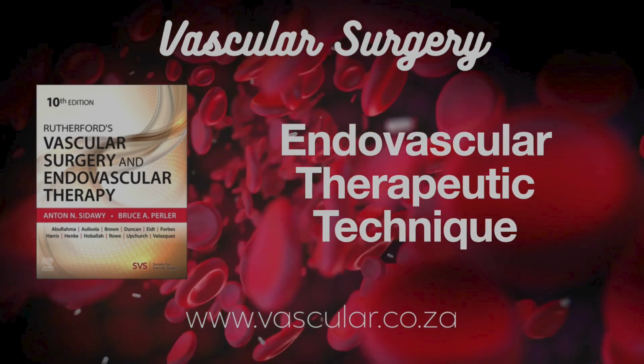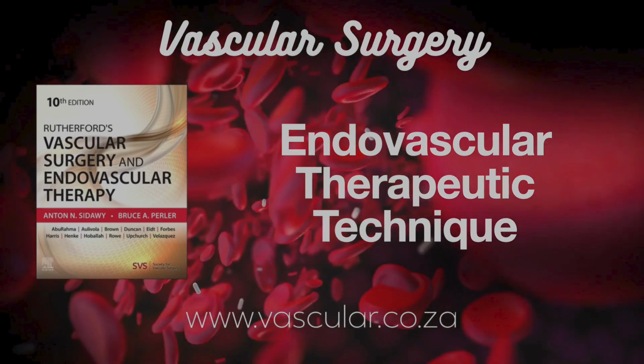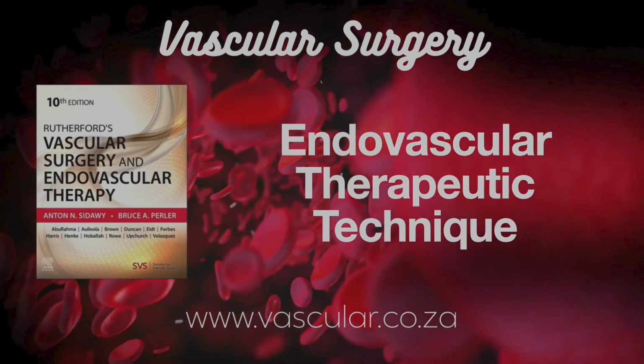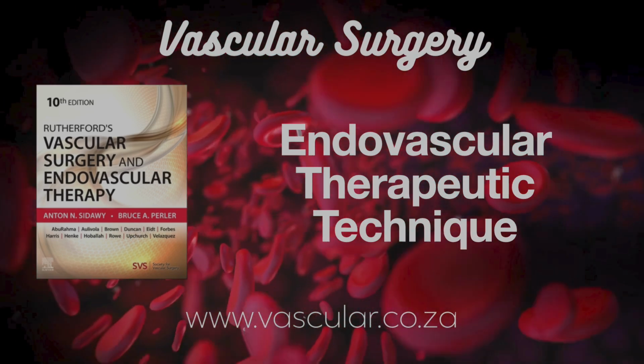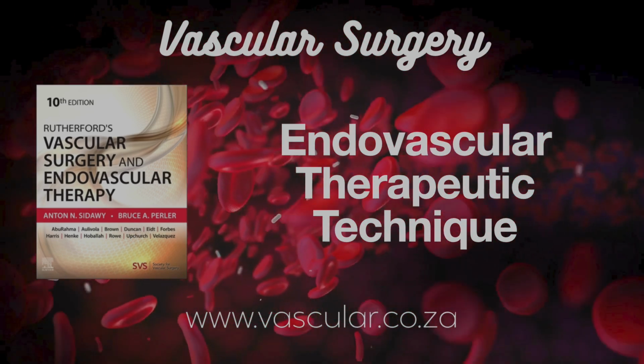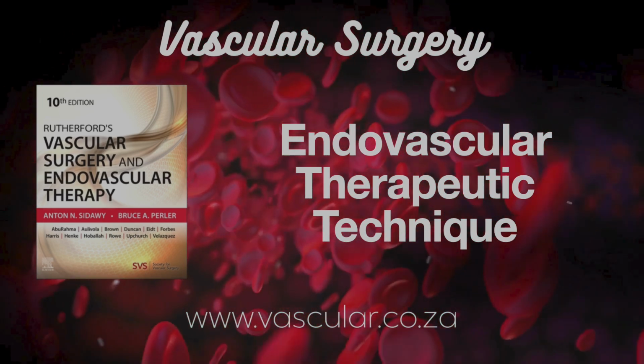And some newer designs try to get the best of both worlds. Open cell body for flexibility, closed cell ends for better scaffolding and edge support. Stents like SMART, Misago, Epic, LifeStent use this kind of hybrid approach. The choice depends on the anatomy and what you're trying to achieve. Interesting designs. Okay, let's move to stent grafts.